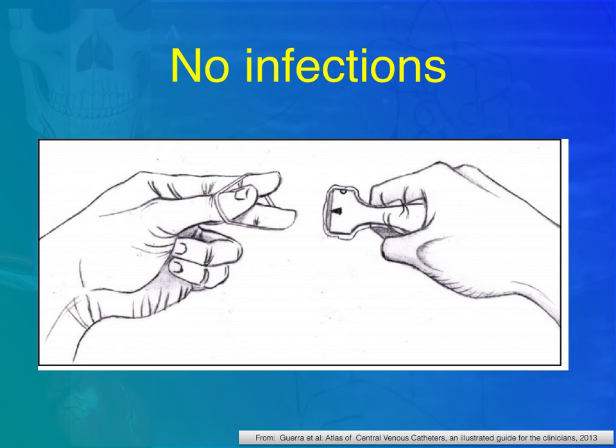To maintain the gel inside the tip of the probe cover and the probe, there are 2 elastic bands that should be placed over the probe cover. Try to squeeze out any air bubbles between the probe and the plastic cover to avoid artifacts.